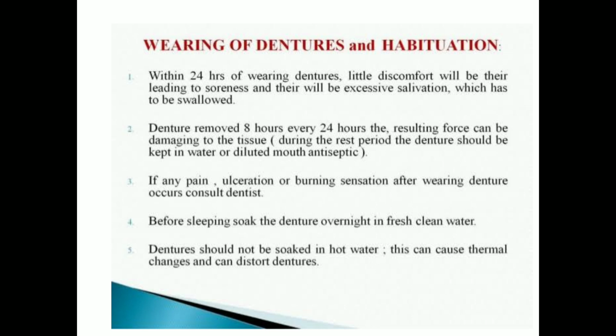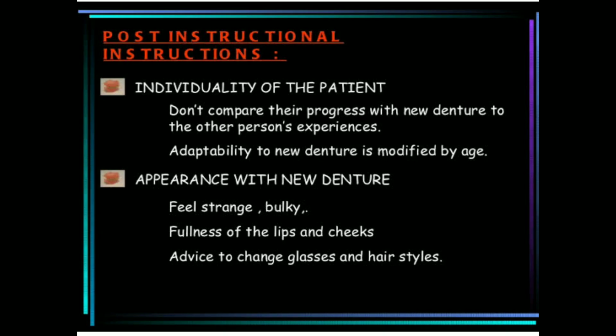Compulsorily, it's a standard rule that he should remove the denture during night time and keep it in clean water. Never ask him to keep it in hot water or warm water. Ask him to keep it in cold water, right? So all these precautions you have to give when you deliver a complete denture to the patient, right?